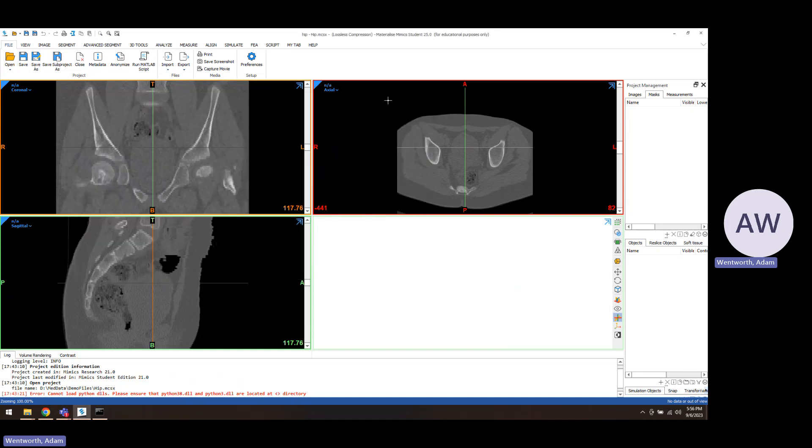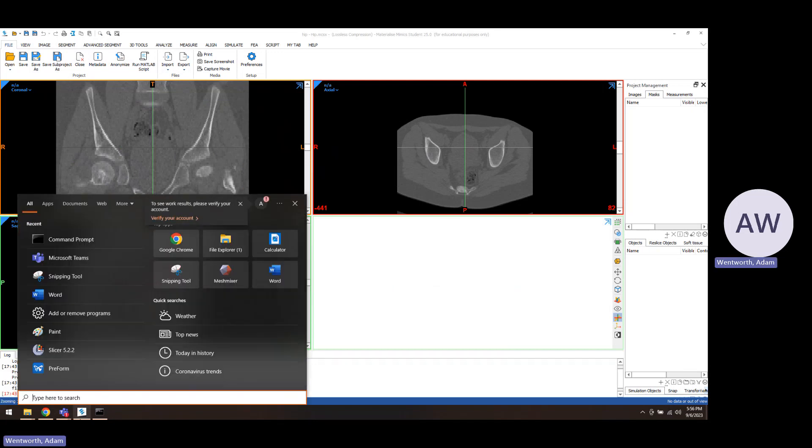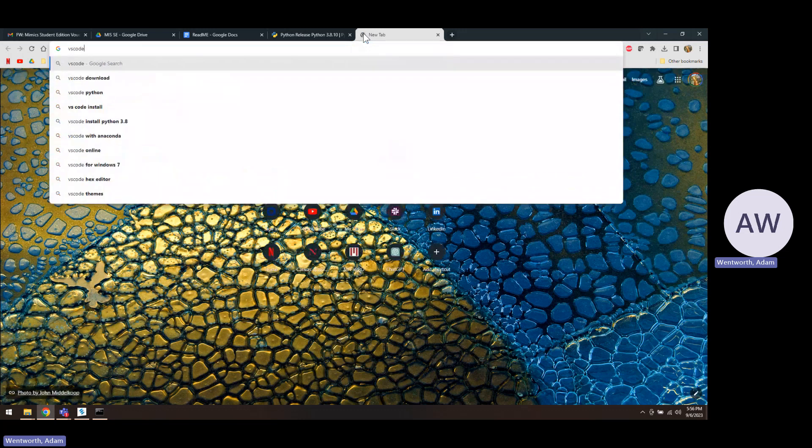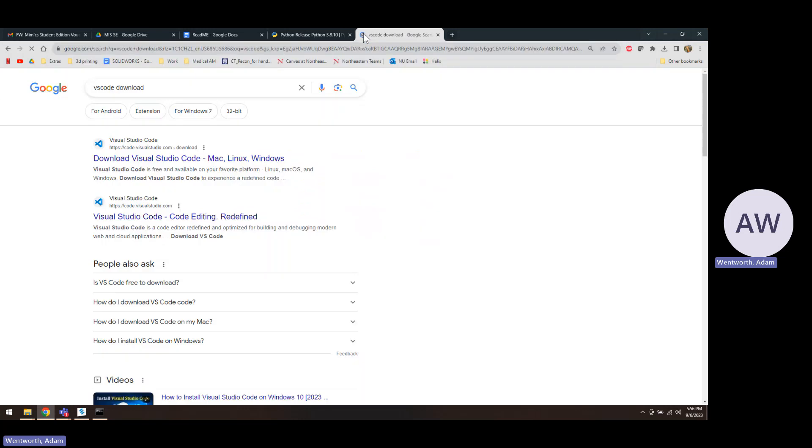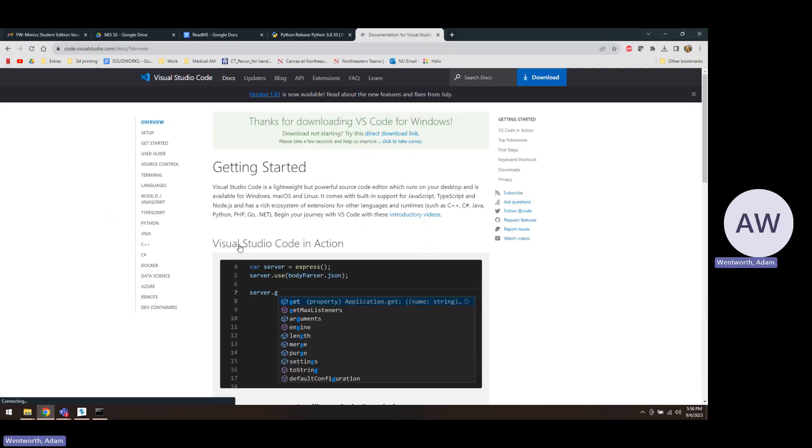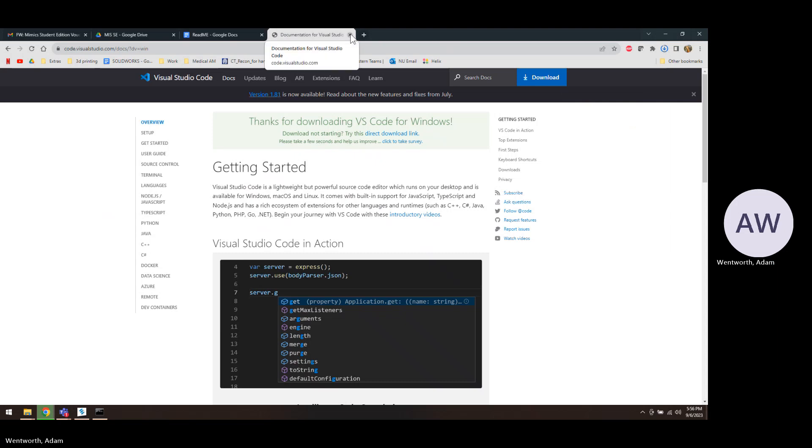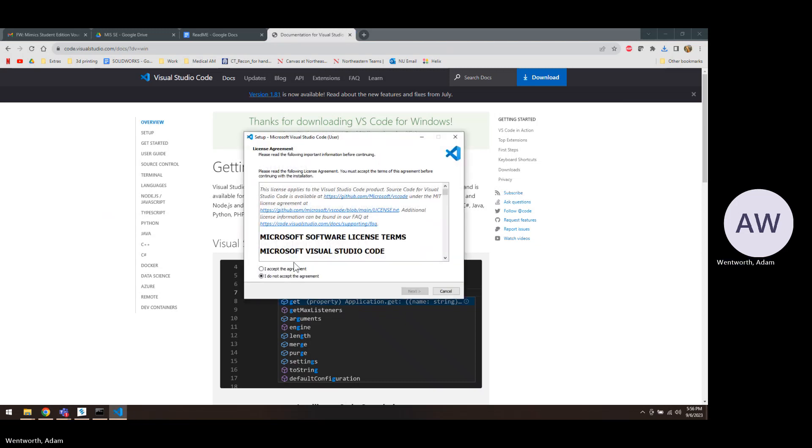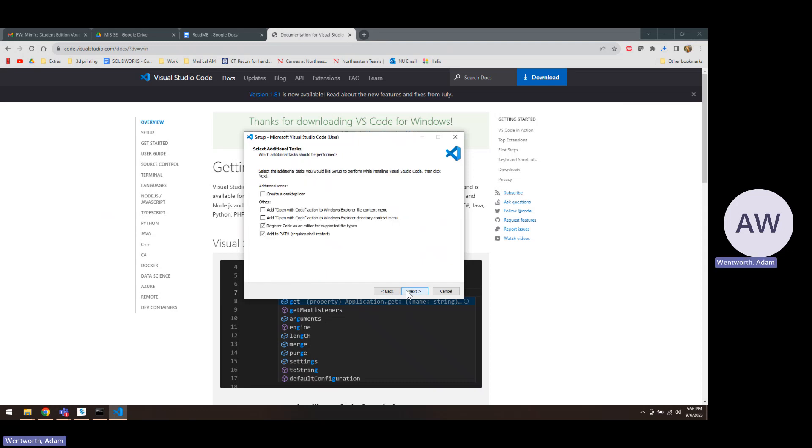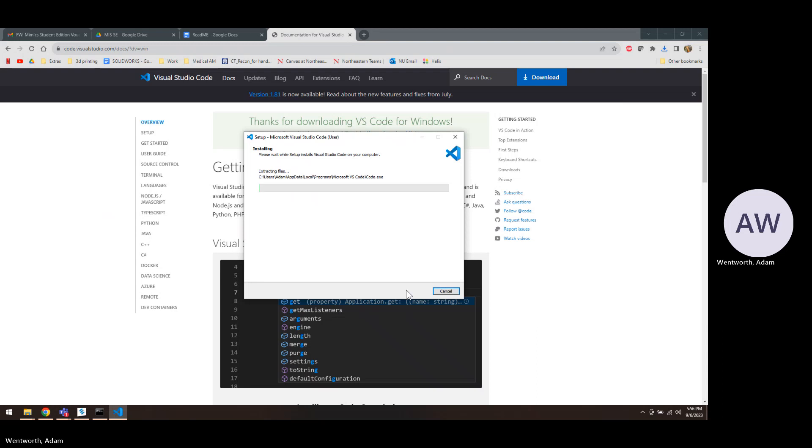Other software you should download is something to write code in, which would be also called an IDE. We would use VS Code, which seems to be a popular IDE to use. So I'll just download this really quick and install that, and just accept the defaults.